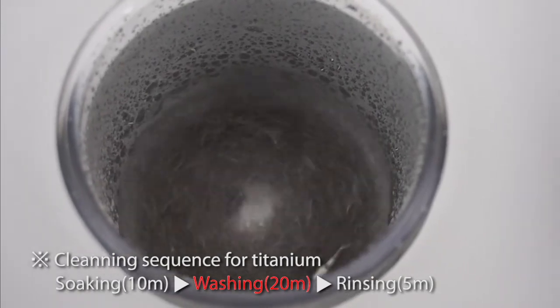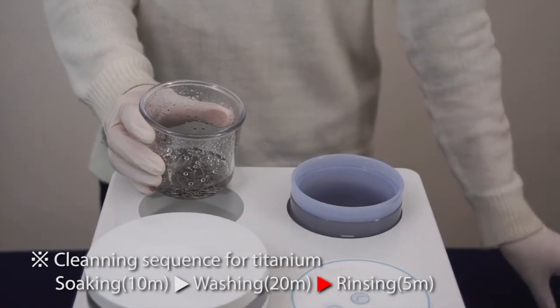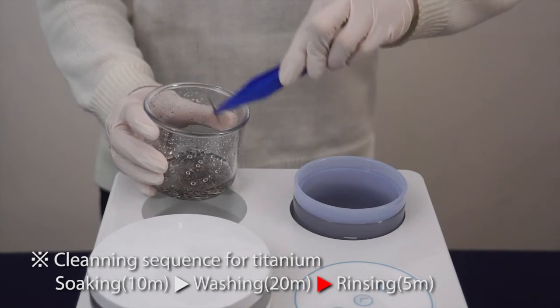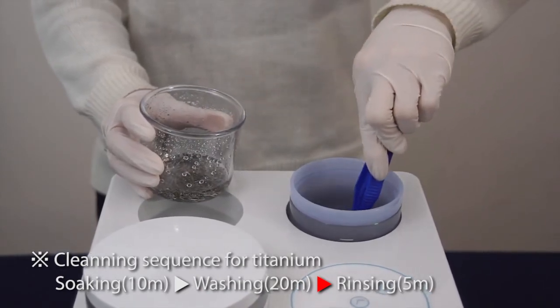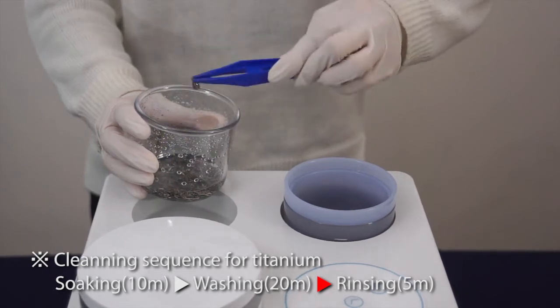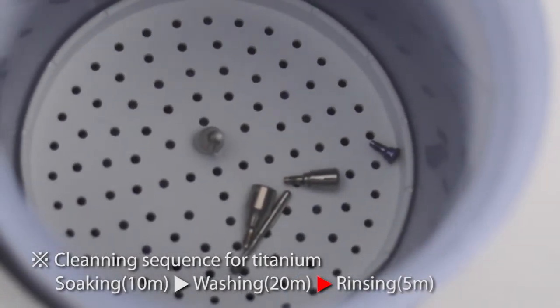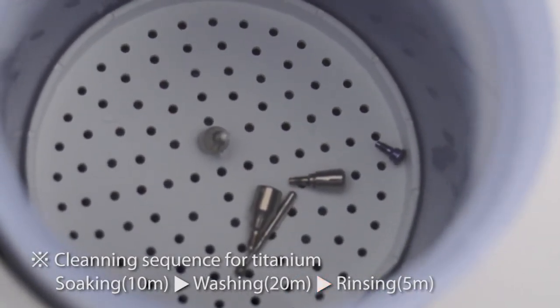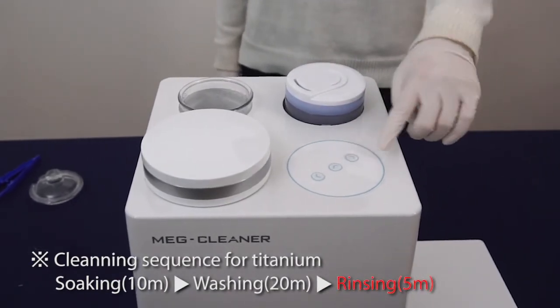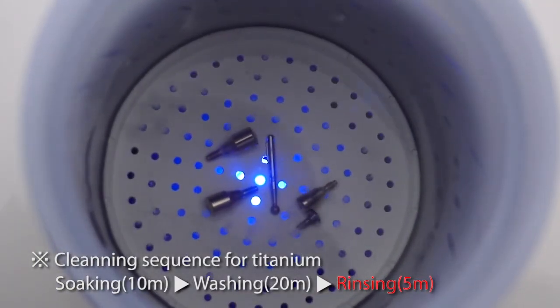When you pick up the object from the washing jar, use the plastic tweezers to easily remove the barrel chip and gently dust off two to three times to remove barrel chips. Move the object to the rinsing jar after washing. Turn the rinsing switch on and wait for the auto-beep and power off after five minutes for rinsing.